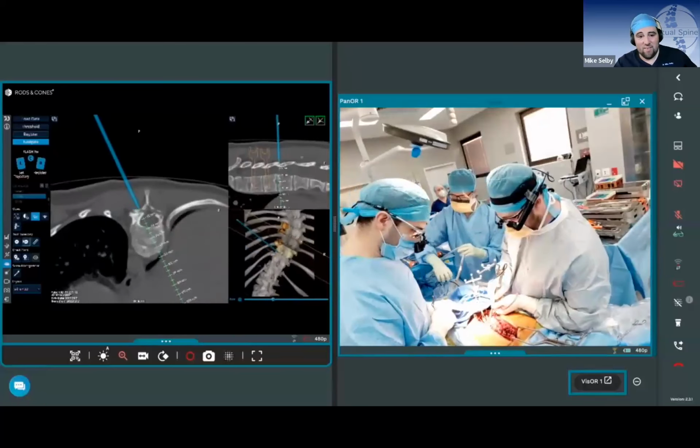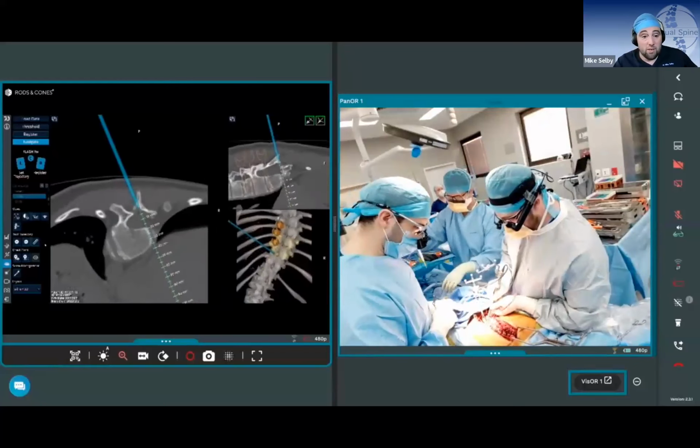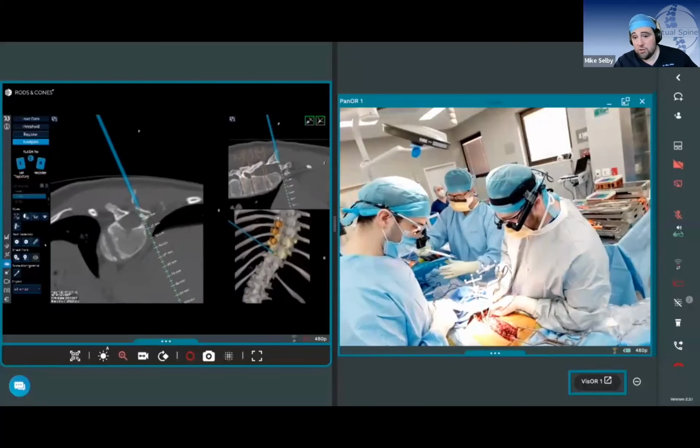Yeah, exactly. And what we try to do is make sure that you're getting your entry point before you look at the screen, and you're getting a feel for what a pedicle feels like. So you can do this if the navigation isn't there or it isn't working. I like the nav burr as well for Ponte osteotomies. I get most of the way there with the nav burr and then just finish the job with the Kerrison now. So it really speeds it up a lot.